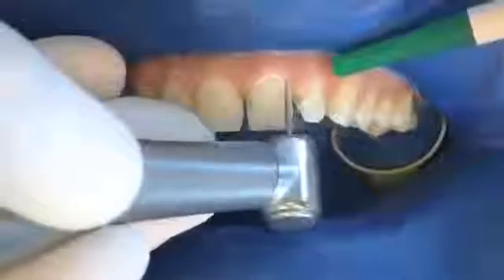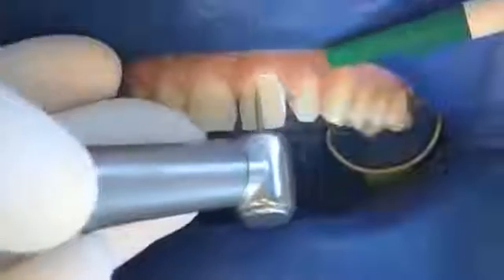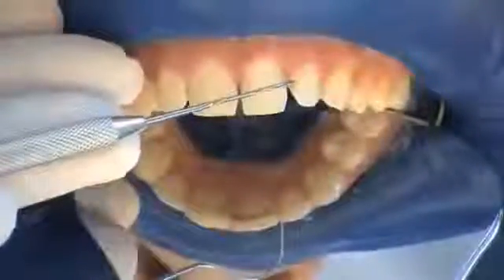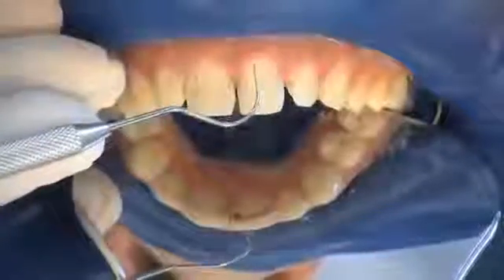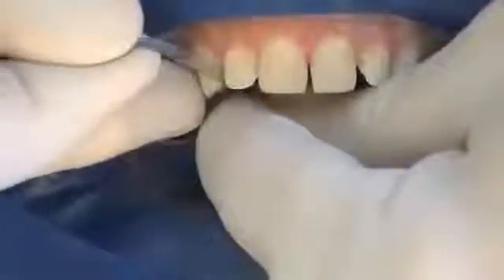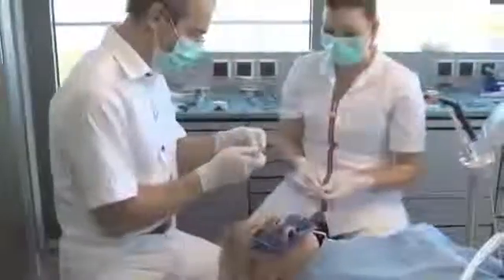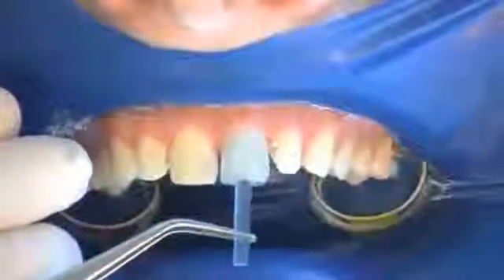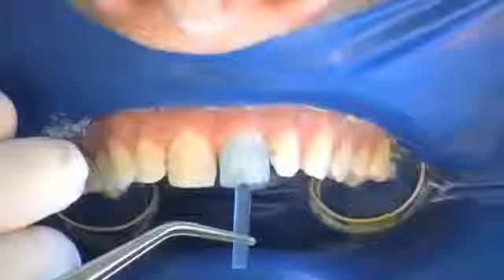Special attention should be given to cervical parts of the enamel. The caries has been removed and all facial parts of the enamel have been treated. The enamel is also treated interdentally to improve conditioning. Shape and size are rechecked after preparation before the COMPONEER is removed from its packaging.